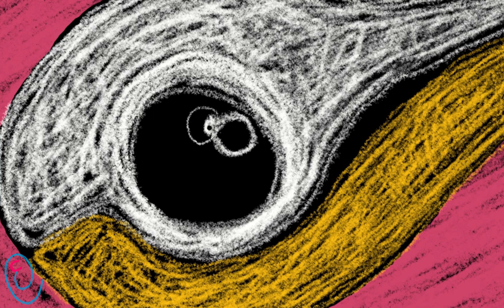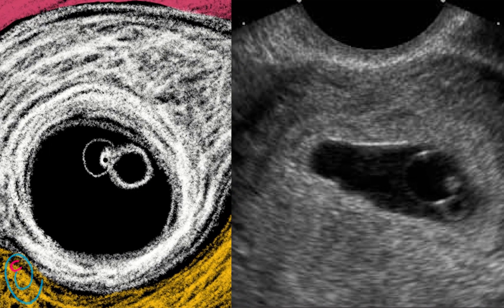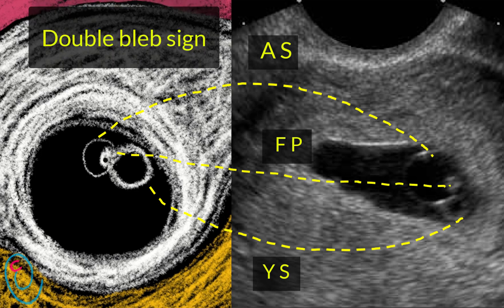Sometimes the amniotic sac is seen at the same time as the yolk sac. This picture of the amniotic sac, yolk sac, and the fetal pole in between is known as the double bleb sign.